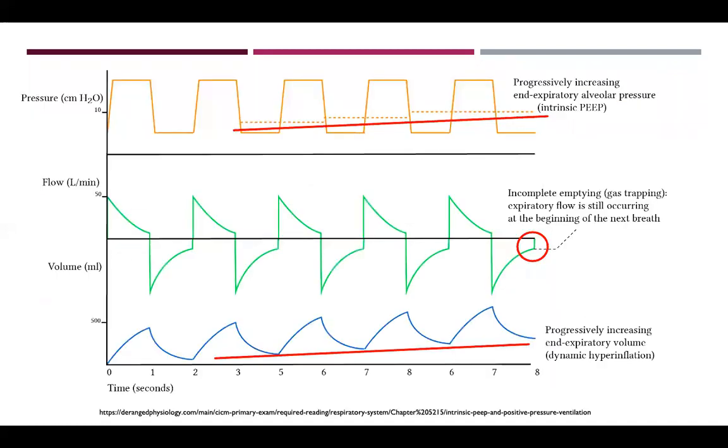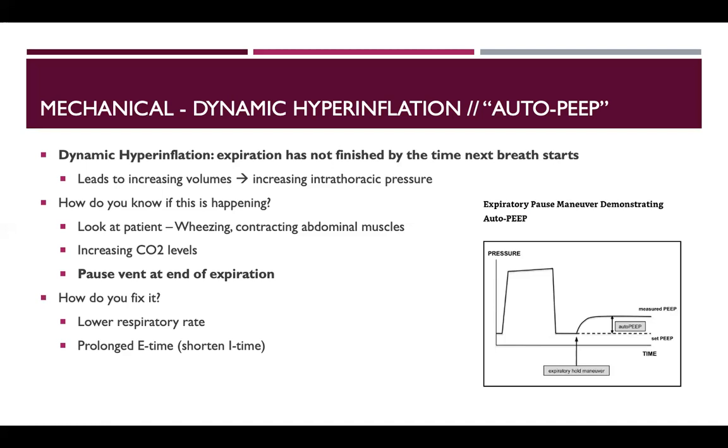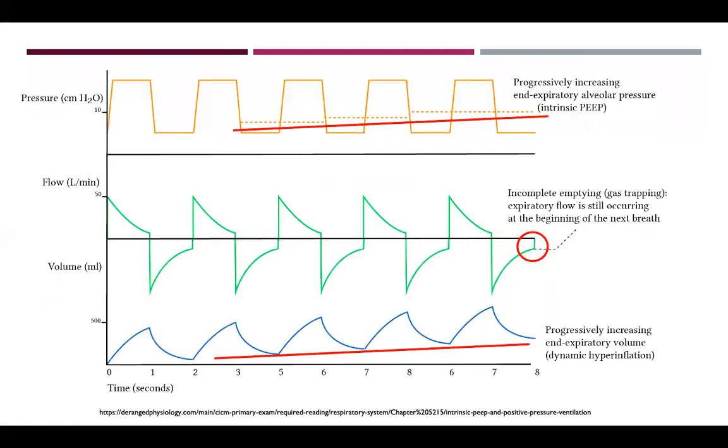Can I add one thing? In terms of how to diagnose this in modern ventilators, if you look at the pressure curve that is being represented on the ventilator, you can easily see that the nadir does not come back to what you set it at. So if you set the PEEP at 5, but you see that the pressure curve is not coming back down to 5 and stops at 7, then you know you have an intrinsic or auto PEEP of about 2.